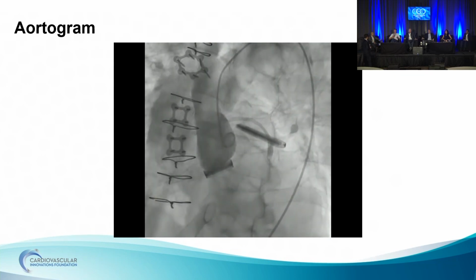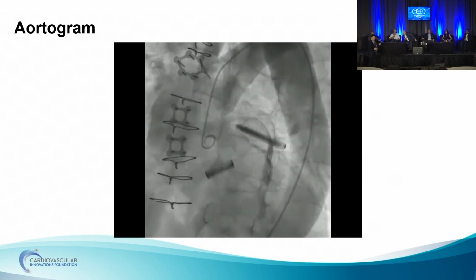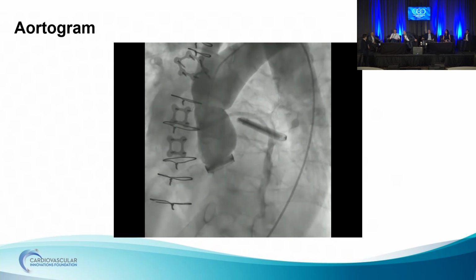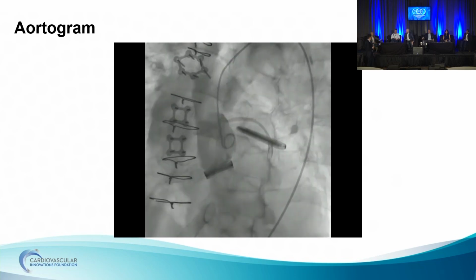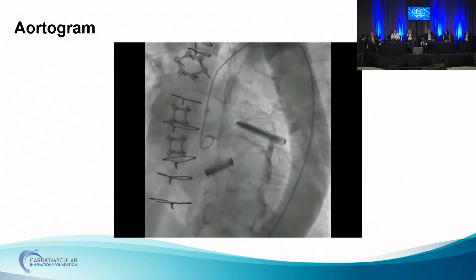At this point, you're looking at some type of either coil or plug, and it's really like, what is the distance between the right coronary and the ostium of this pseudoaneurysm, and do you have room for a disc or something? The inflow is not coming off the RCA. Obviously, the easiest covered stent is always just to put an RCA covered stent and be like, yay. That would have been great, but no is the answer.